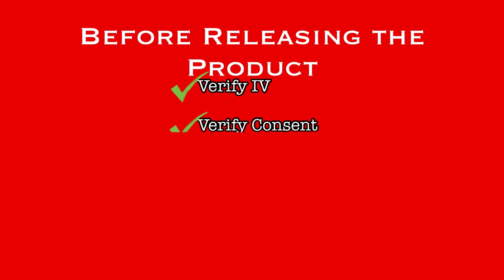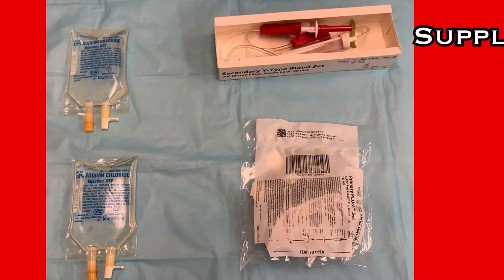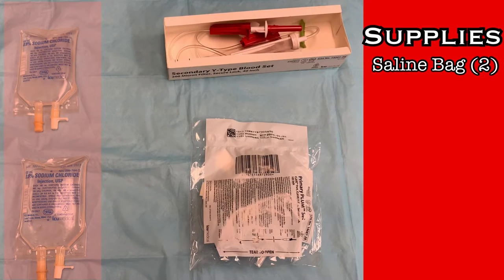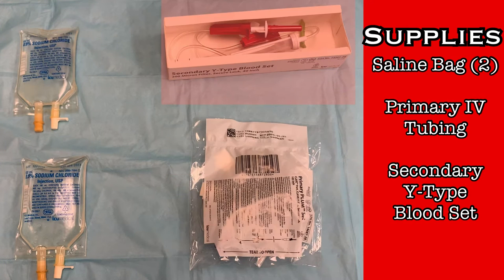With an IV in place, consent on the chart, and vitals within expectations, the next step is to gather the necessary supplies. Two bags of saline will be needed — small volume bags such as 100 milliliter or 250 milliliter bags are all that will be necessary for a blood transfusion. Normal saline is the only IV solution suitable for transfusion of blood products. For tubing, you'll need a primary tubing set and a secondary Y-type blood set.